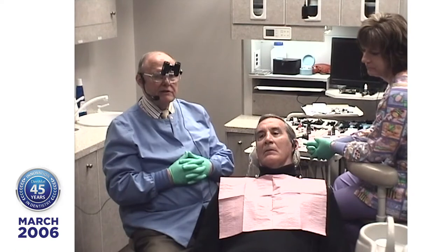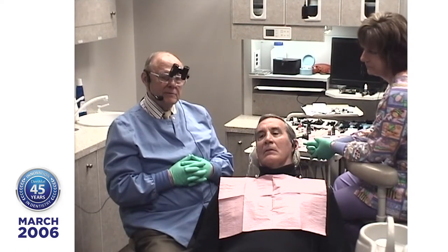And when you take that impression, you want to be sure you leave it in long enough. If you ever have a case come back and your lumineers fit the model and they don't fit the teeth, it's probably because you had distortion in the impression. Can't see distortion, so the best way of guarding against it is let it stay in the patient's mouth for an extra minute or so. It's time well spent for insurance.